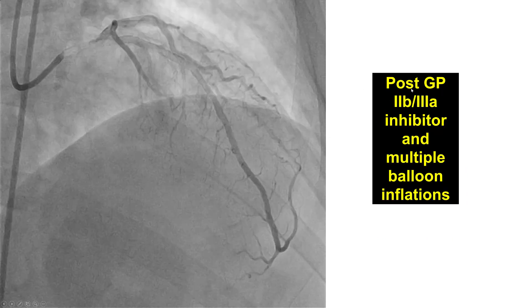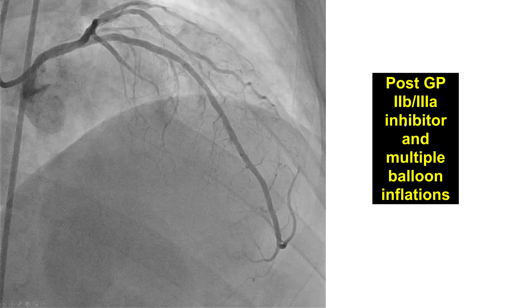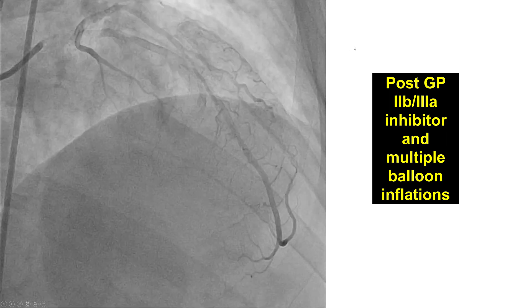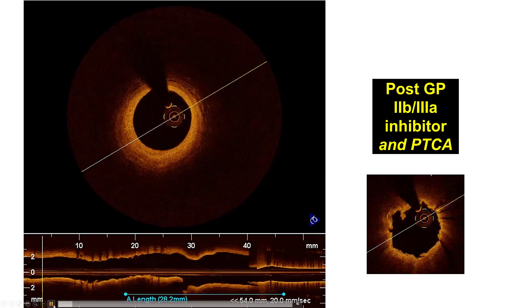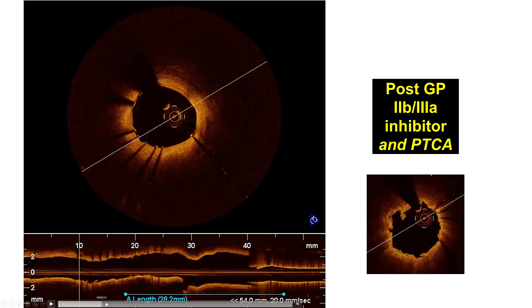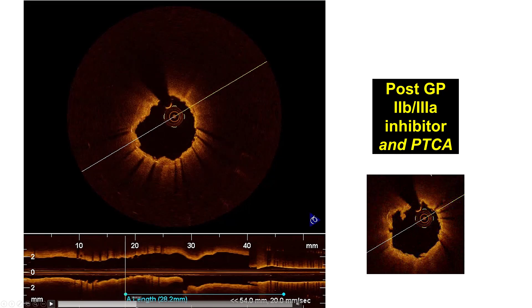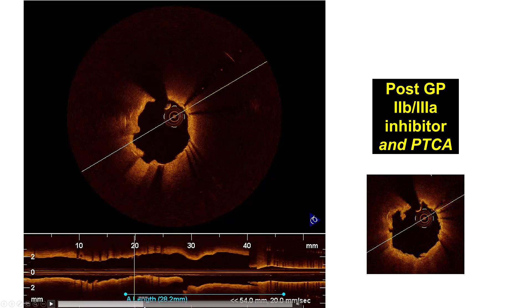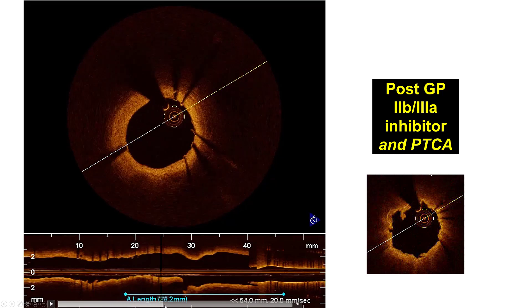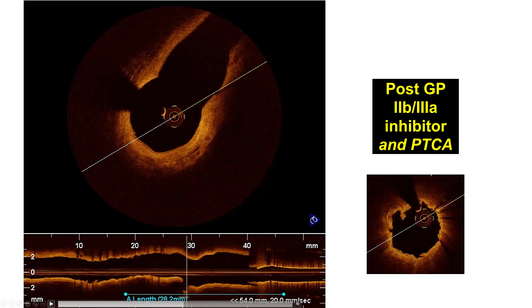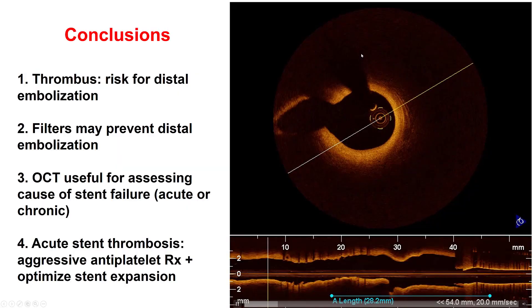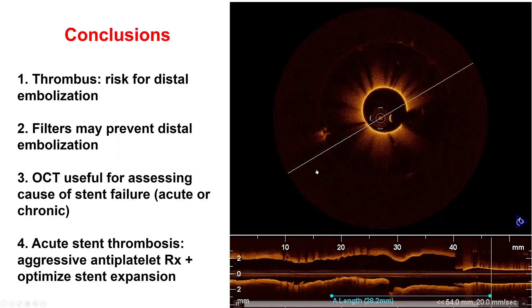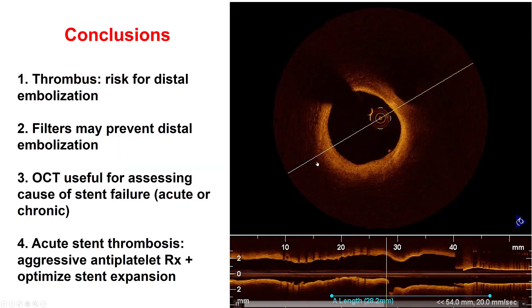We administered an intravenous glycoprotein IIb/IIIa inhibitor and performed multiple balloon inflations, which improved the stenosis. A repeat OCT run demonstrated that the thrombus had significantly improved, with only a mild amount of residual thrombus inside the stent — a nice result. It was a good thing we caught this early; otherwise, the patient might have had complete vessel occlusion due to stent thrombosis.